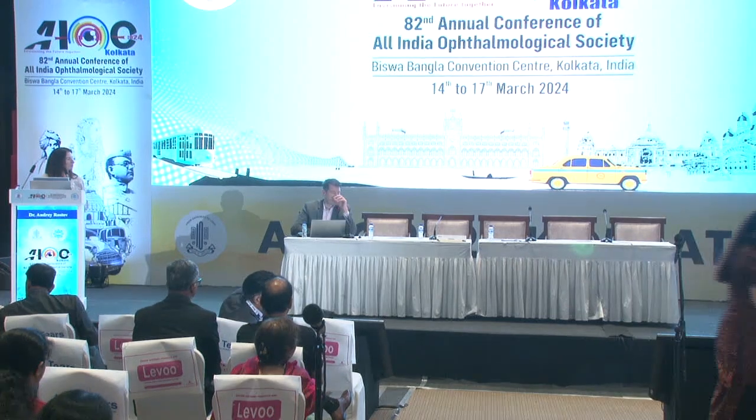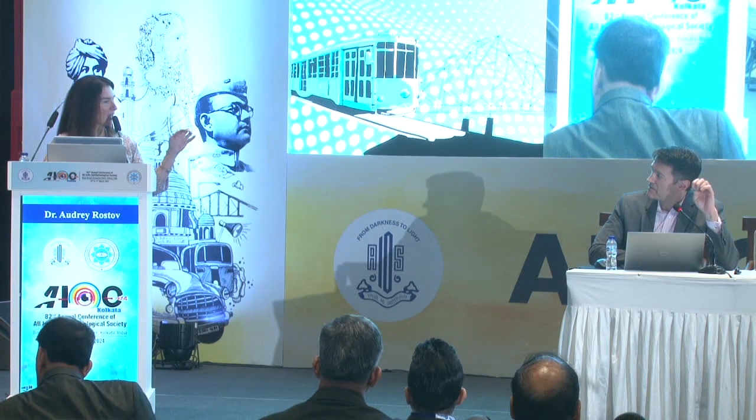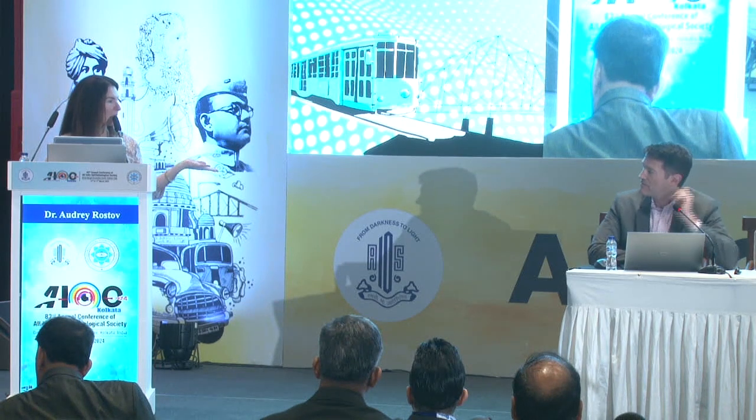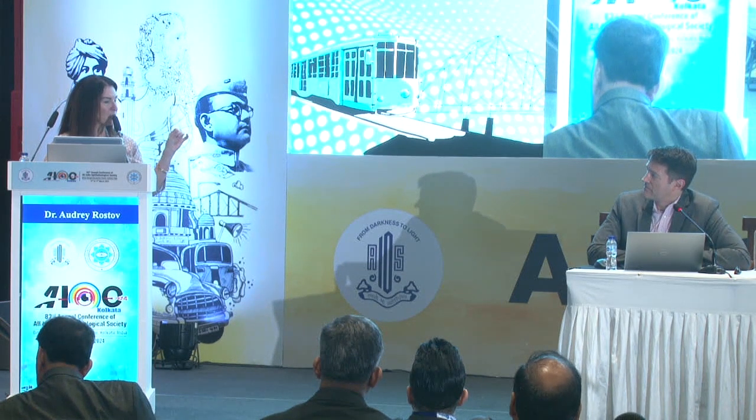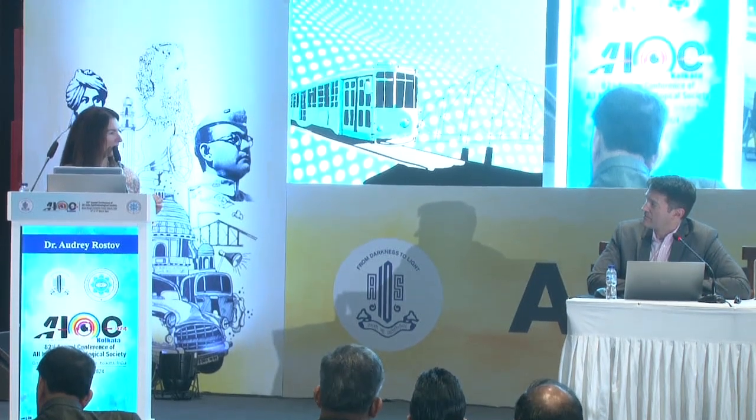I have a question. You mentioned a couple of times avoiding the filter zone, like during implantation. What happens? Why is that? You can damage it and you can scratch it. And I guess theoretically, one of two things. One, you can damage the lens, but also potentially that pigment, you don't want to release that pigment.